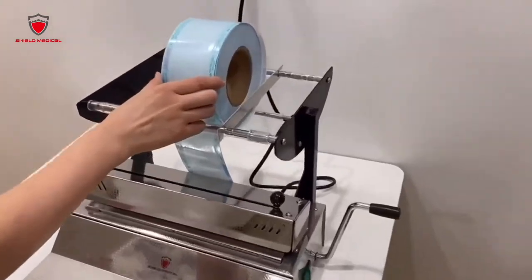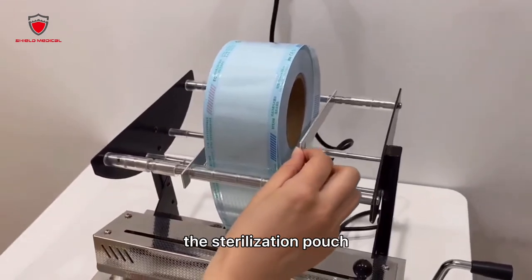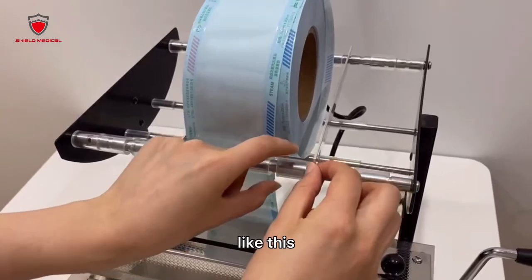Here is our sealing machine, and you need to choose the appropriate width for the sterilizer pouch. You can adjust the width by moving this bar here, like this.